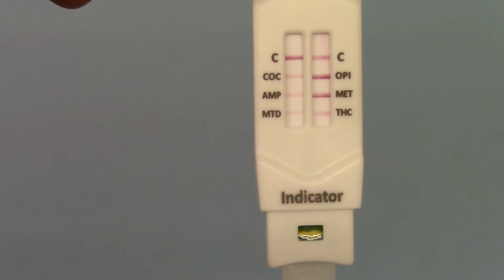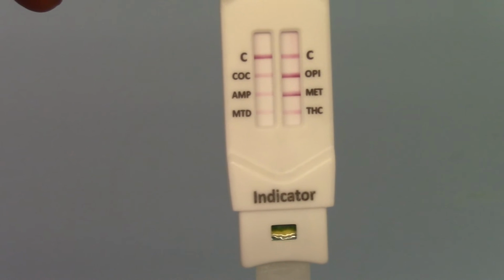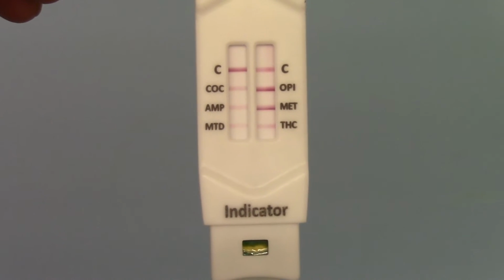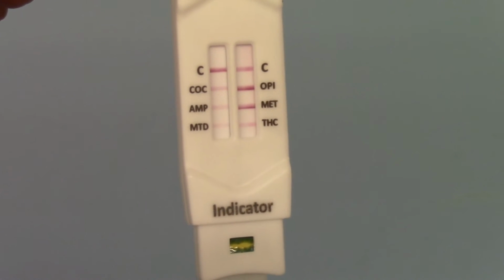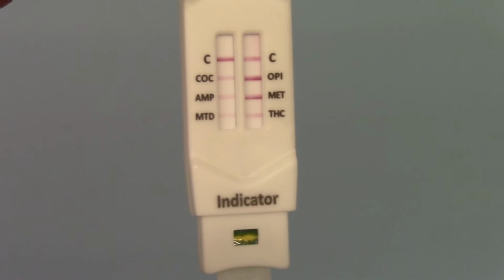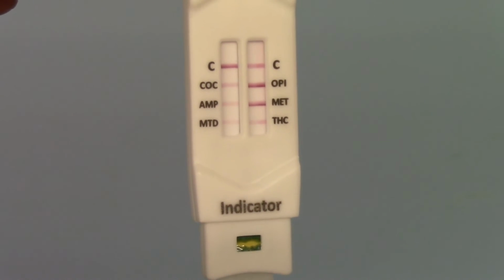Any line formation at the correct read time in the presence of a control line is a clear negative result. Do not try and interpret any level indication or other significance in the thinness or faintness of a test line. It has to be interpreted as a clear negative. This is a normal phenomenon for urine and saliva drug testing.